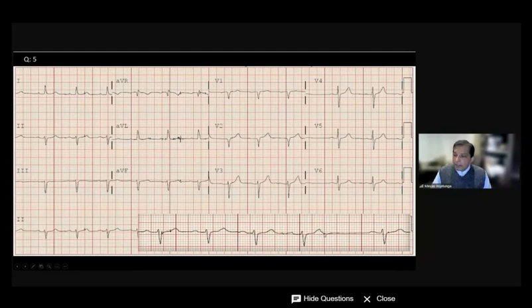And because of that, similar to the previous patient, that P wave came early. Because if you count P to P interval, P to P, P to P, the next P should have been somewhere here. But this P wave came early and that got blocked. It didn't go to the ventricle, and the sinus node got reset and started again. So the key here is this is not sinus node dysfunction, but a premature atrial complex basically inhibited the sinus node temporarily. And that's what it is.